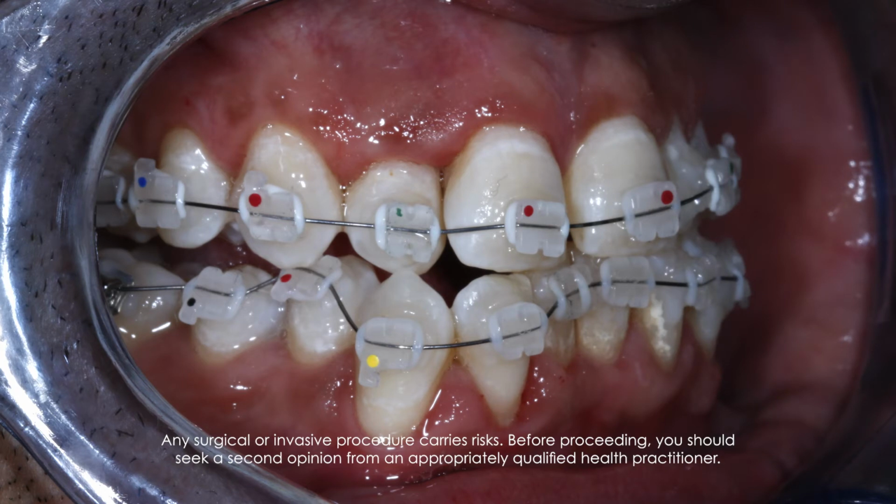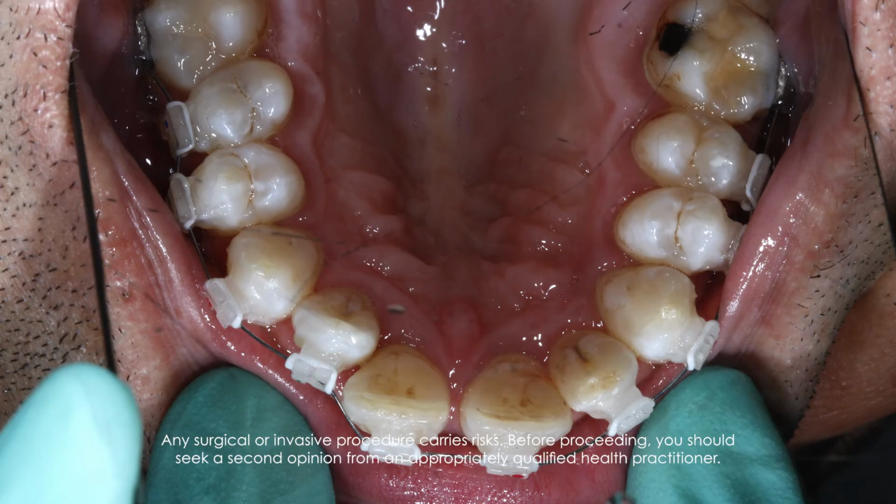Now, the other thing with ceramic brackets is that while they might look really nice and white initially, over time they'll end up staining and looking more yellow or brown, which sometimes gives not a very aesthetic look, because it's not white and it looks a bit yellow, it tends to have that connotation that it's a bit dirty.